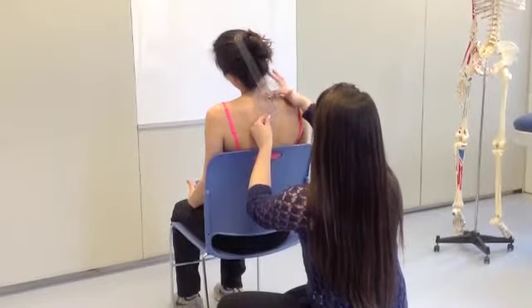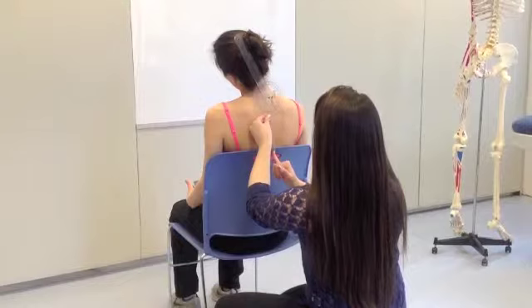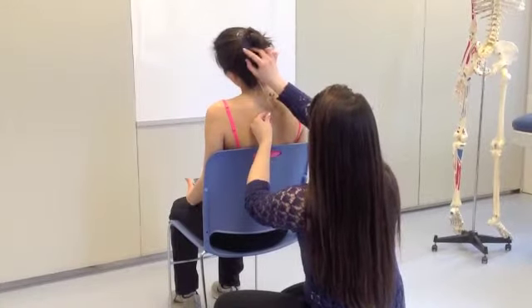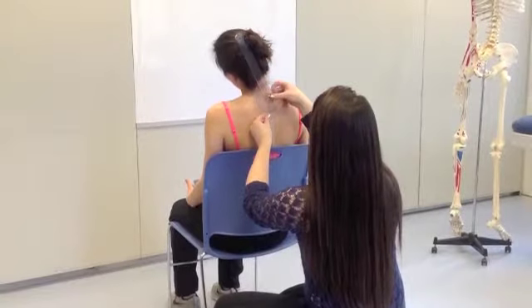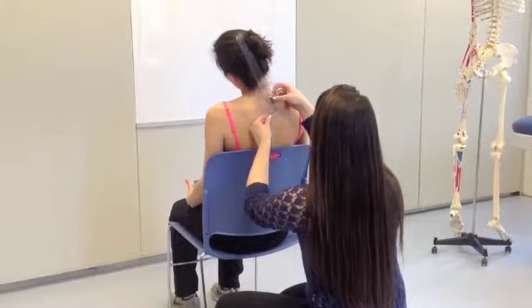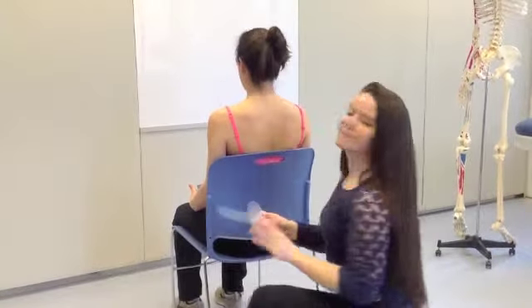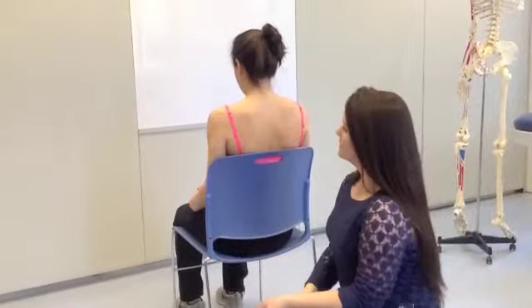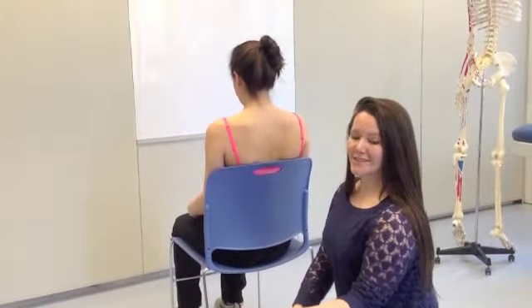Okay, so we make sure that the fulcrum is still in line with C7, stationary arm is still in line with the spine, and then the movable arm is in line with the occipital protuberance. And then to this side, Kelsey got about 28 degrees. You can go ahead and look straight ahead. So a little bit more to the left than she did to the right. And that's how you assess cervical side bending.